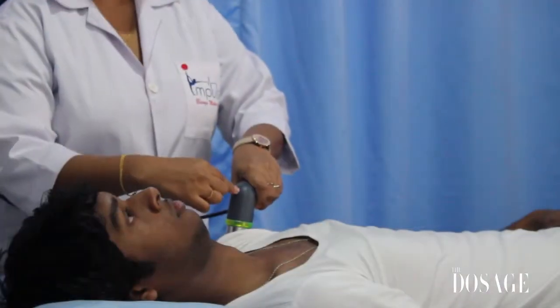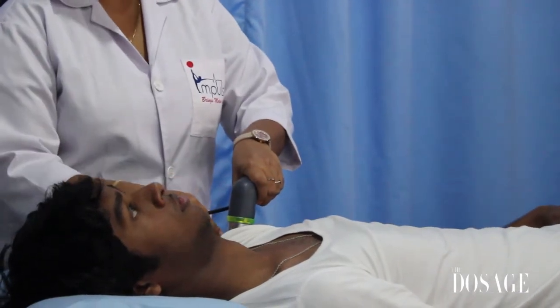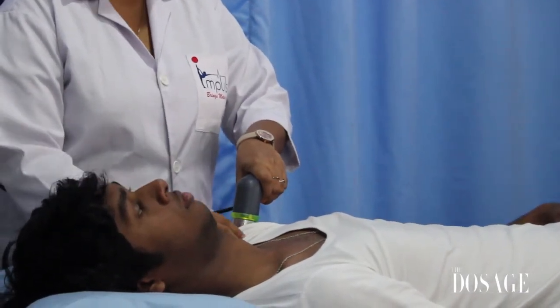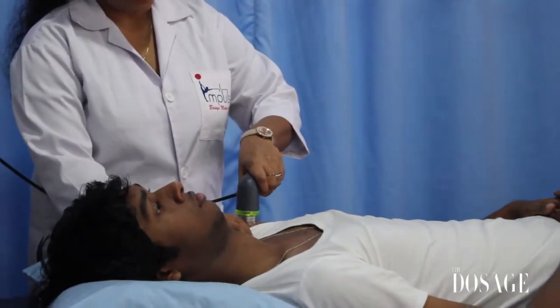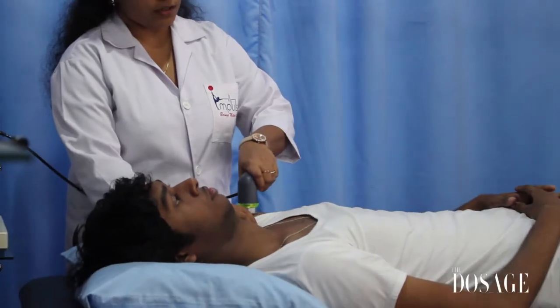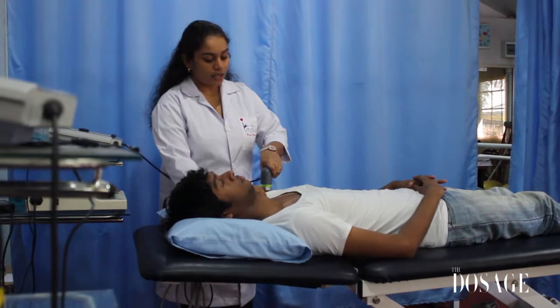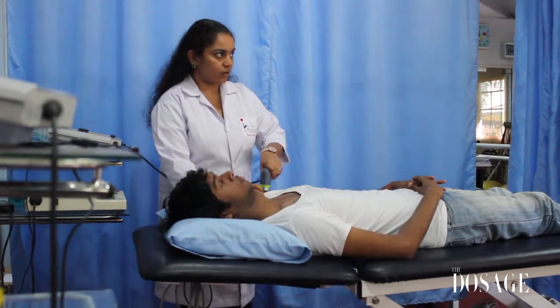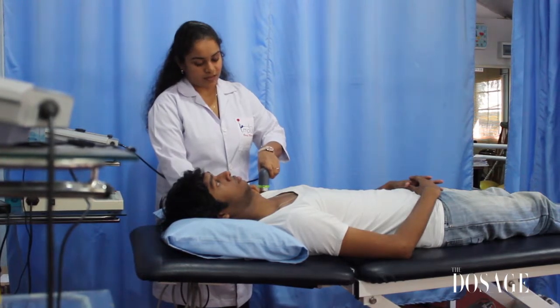This is called a treatment head. Before applying to the patient's skin, we have to apply a gel. This treatment takes only 6 minutes, and we usually use this to treat localized pain. So he is having pain only in the anterior shoulder, only in one spot. That's it.